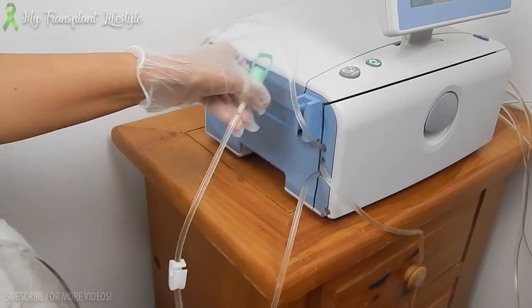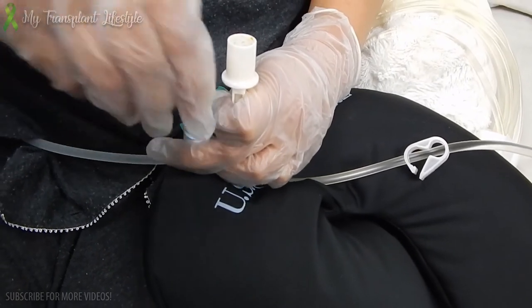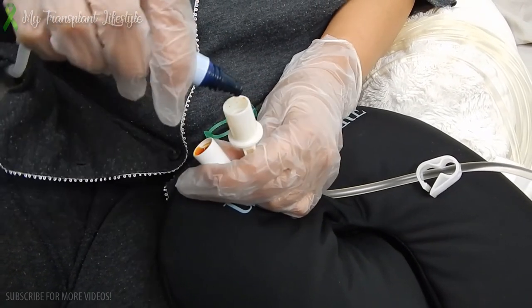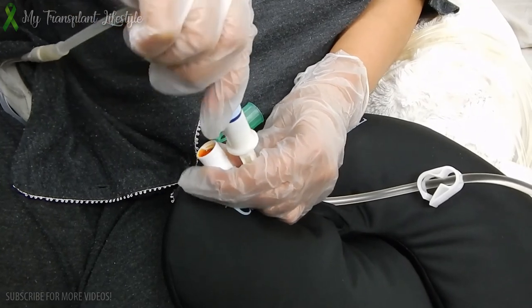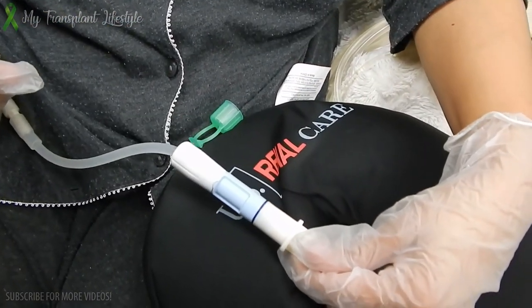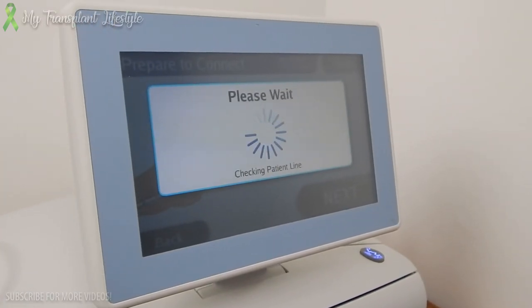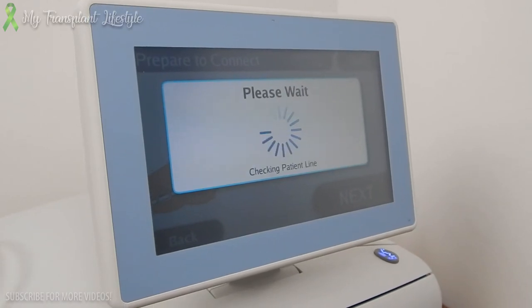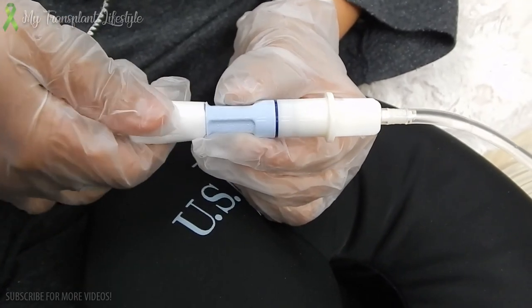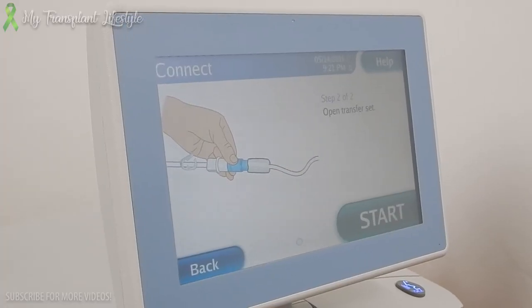Next, take the patient line and attach it to the transfer set. Last step is to open the transfer set. And now we're ready to start dialysis.